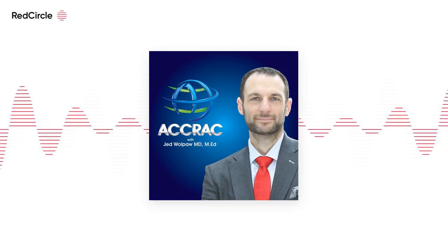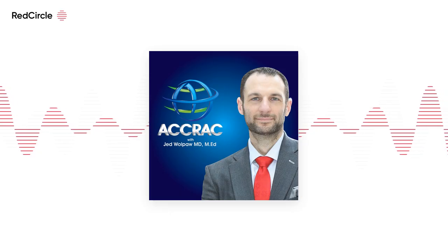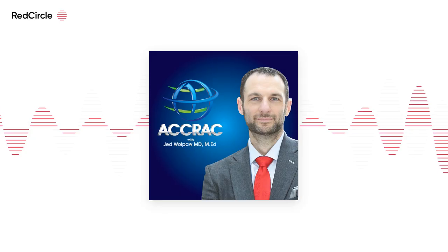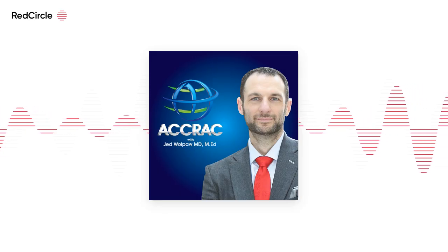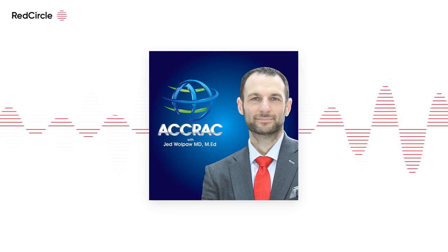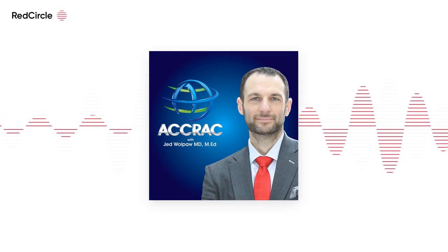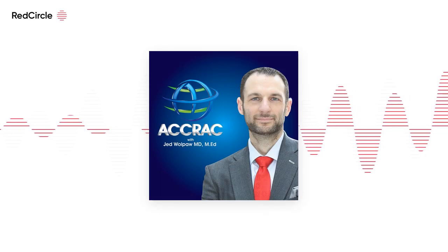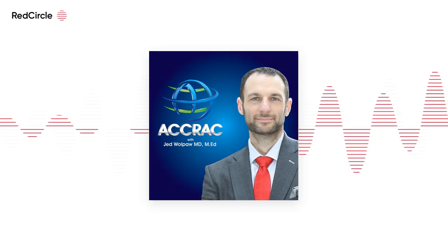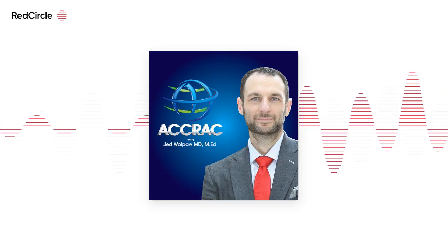And so the idea here is that, physics wise, everyone thinks that the pressure inside an airway is what matters. But of course it's not, right? It's the difference between the pressure on the inside and the pressure on the outside. And so I think in many ways, this is what you were just saying, Tom, if you're willing to go high enough on the PEEP, you could just look at driving pressure because you're going to minimize your driving pressure when your PEEP is appropriate. But you may need that help of that esophageal balloon to tell you, well, actually 30 is the right PEEP. Otherwise, you might not even be willing to get anywhere near that.